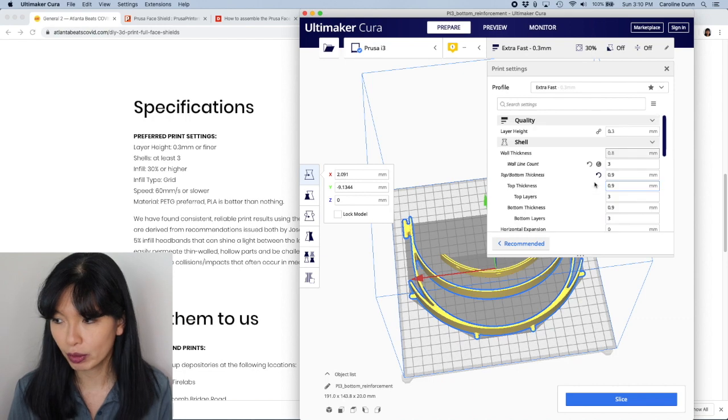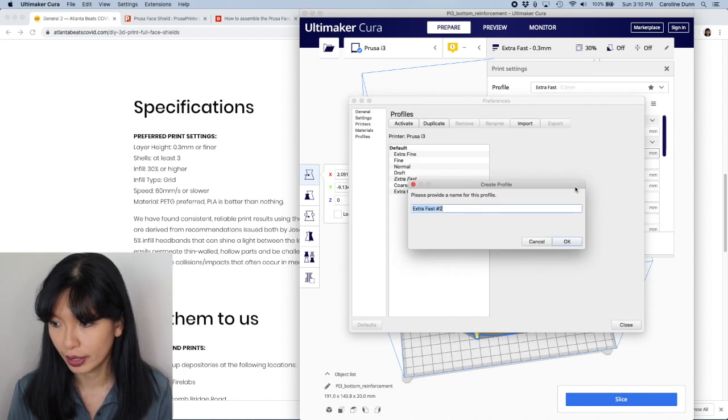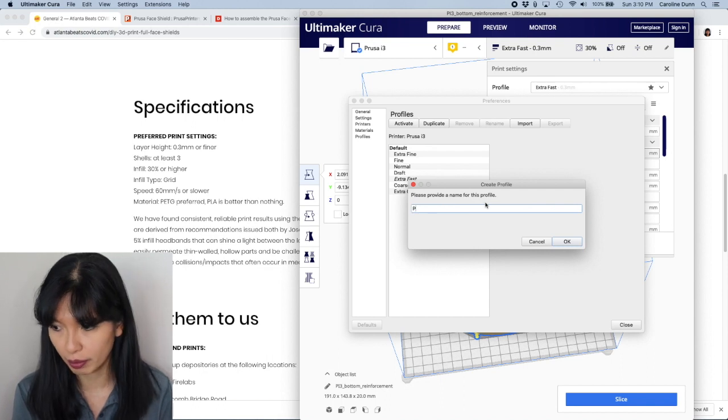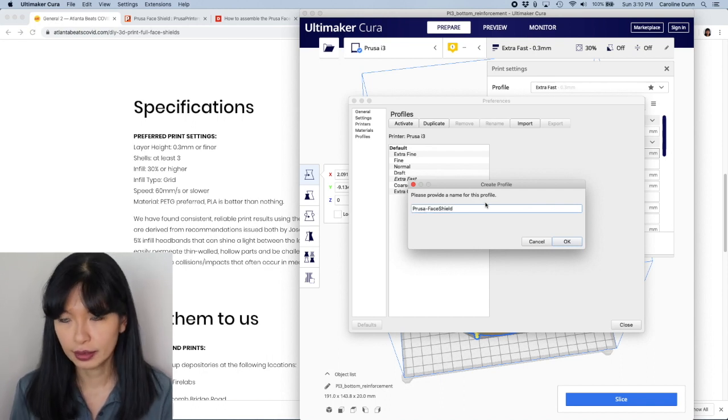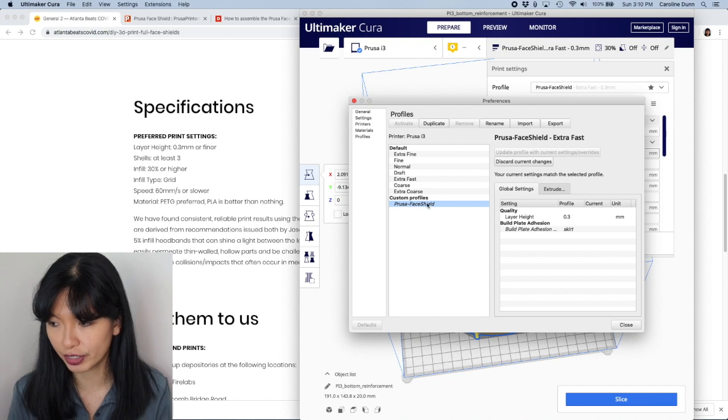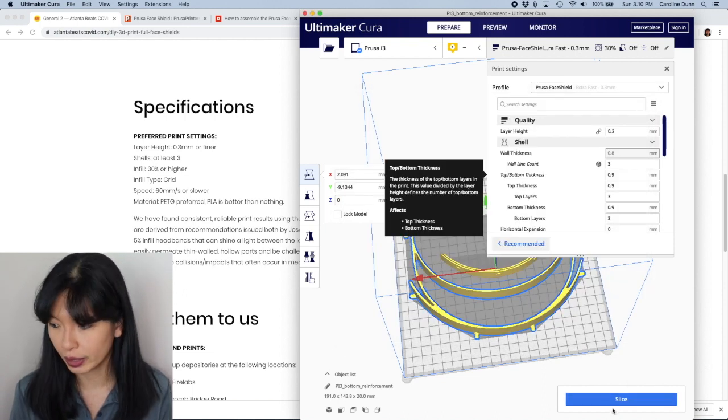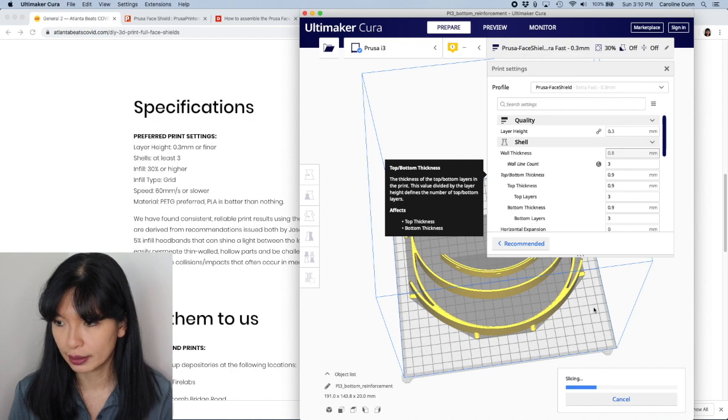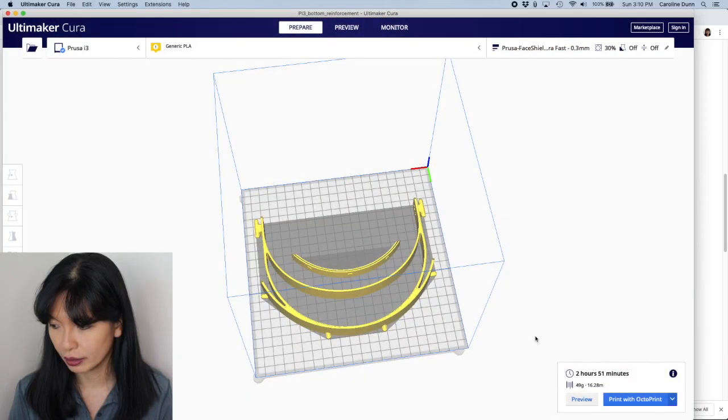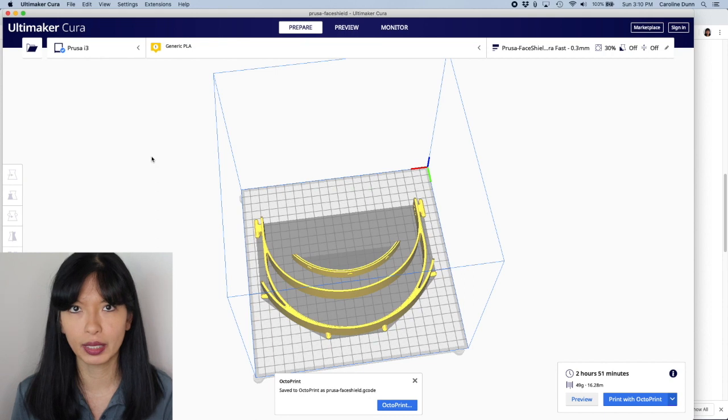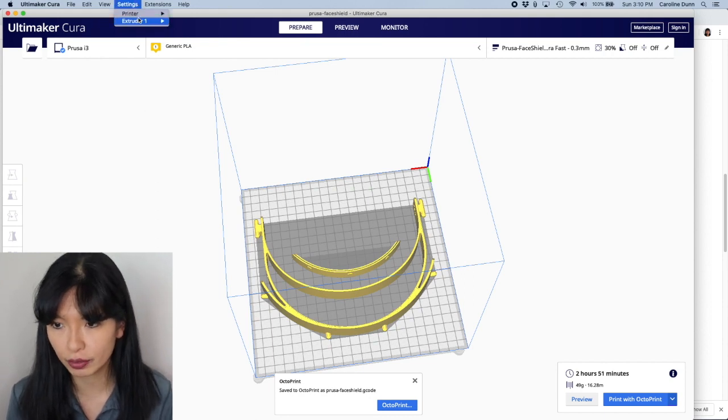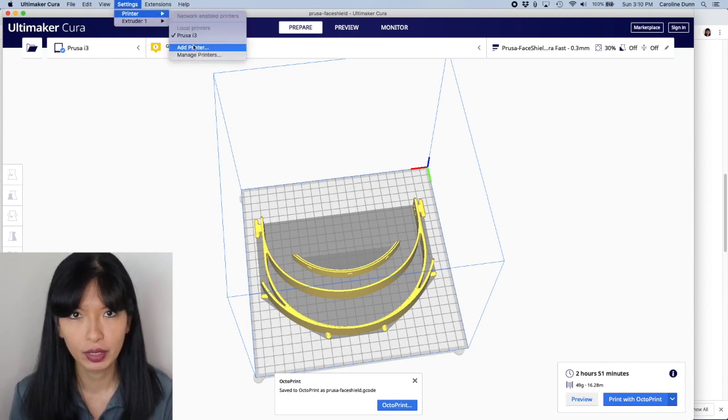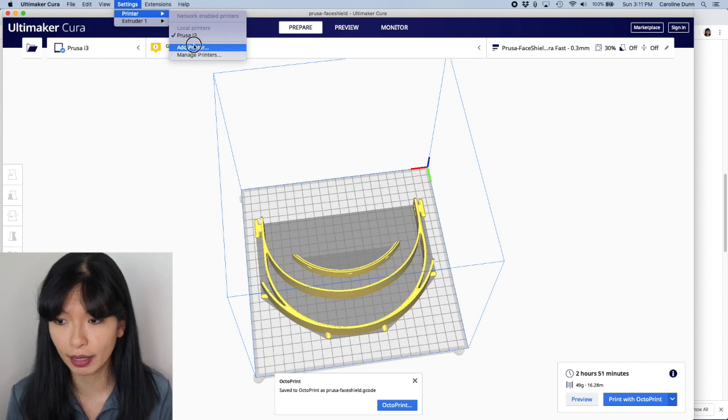Now what I'm going to do is I'm going to save my profile here, create a profile, and I'm going to call this my Prusa face shield settings. I'm going to hit okay. So that is my Prusa face shield settings. So now I've got that already done and I'm going to hit slice and it's slicing now.